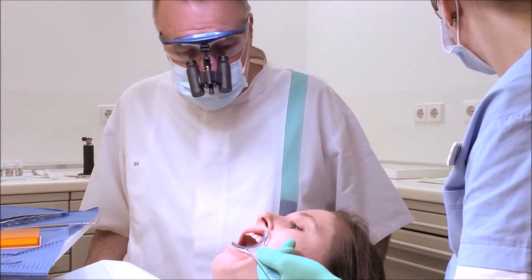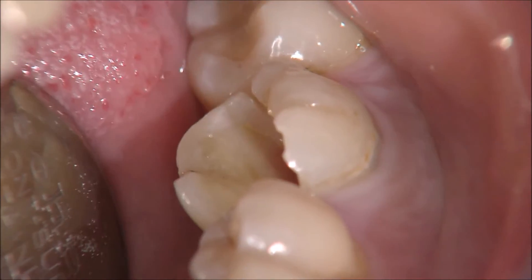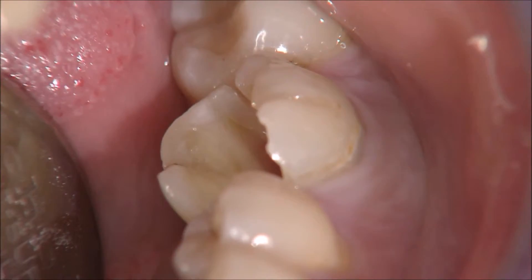Welcome to another chapter of our Dental Treasure Box. We have tooth number 36 that was successfully endodontically treated, and we want to place a final restoration.